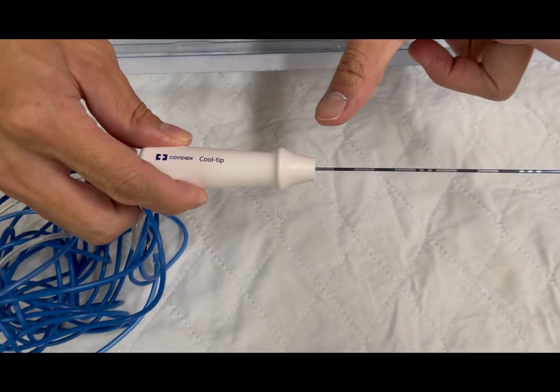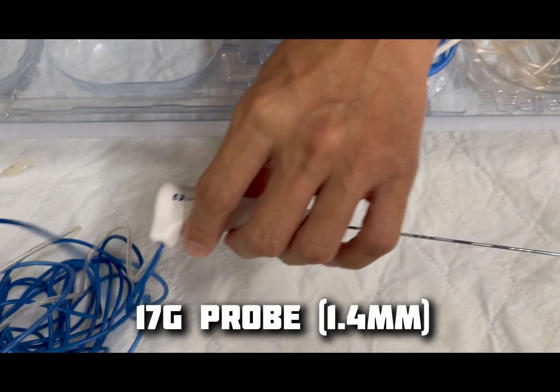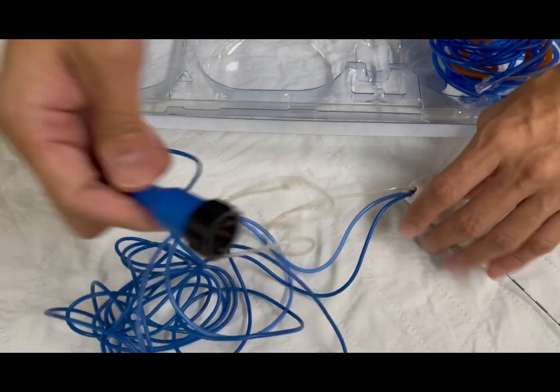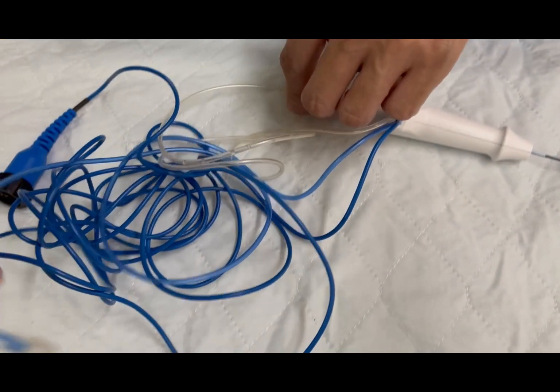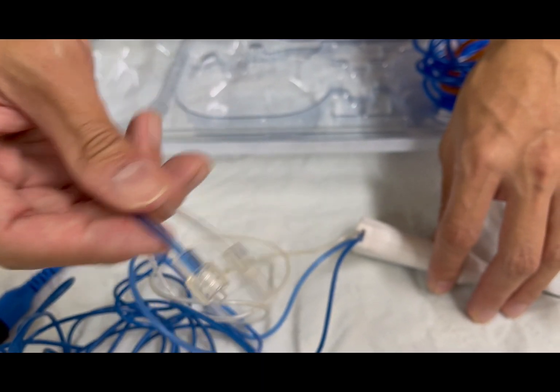There are markings on the needle 1 cm apart. The size of the needle that we're going to use today is 17 gauge. This end will be plugged into the RFA system. These channels allow cooling saline to be connected to the peristaltic pump.